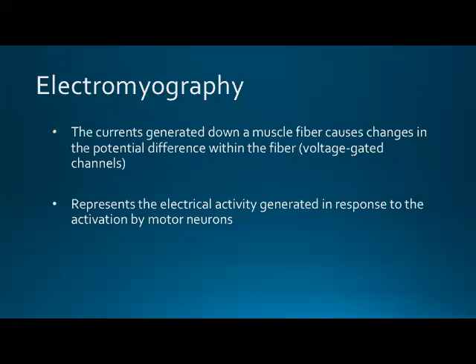And that change in electrical potential occurring down the muscle fiber is what your EMG or surface sensors are picking up. Now, what it picks up is really dependent upon where you place those sensors. If you place those sensors directly over what we call an innervation zone, that means the point at which that nerve and that motor unit are coming together, so the nerve is innervating that muscle fiber, we'll actually see a decrease or a cancellation of our EMG signal, so we won't pick up anything.